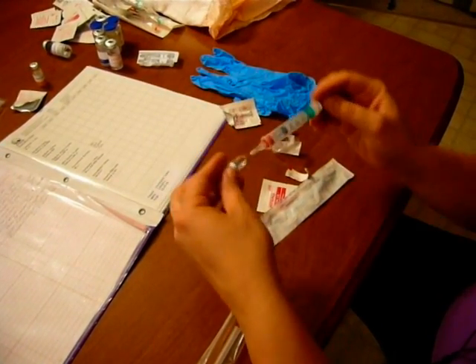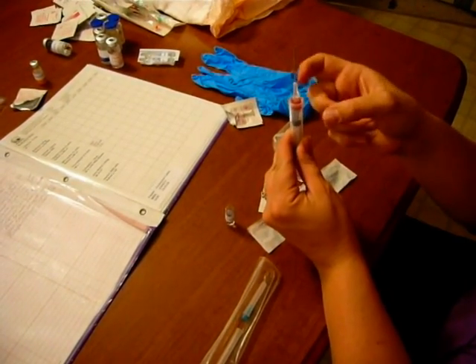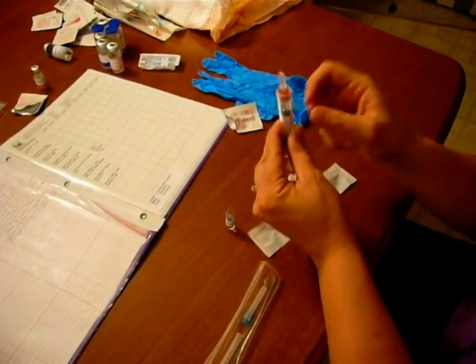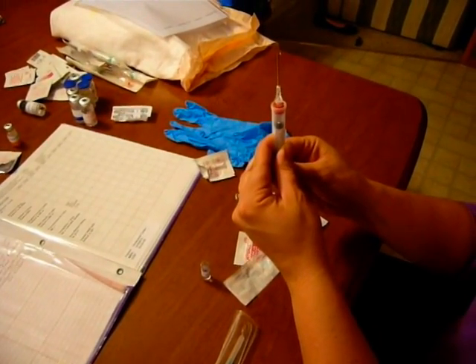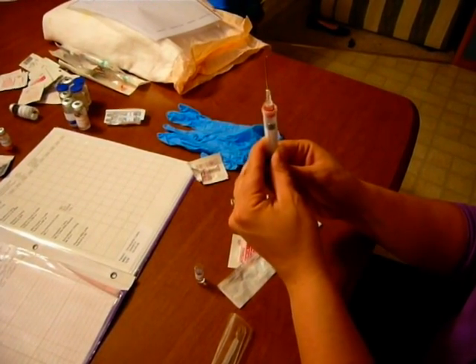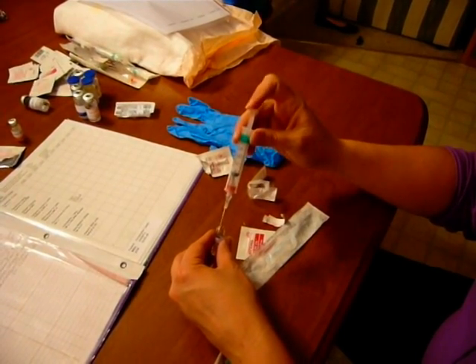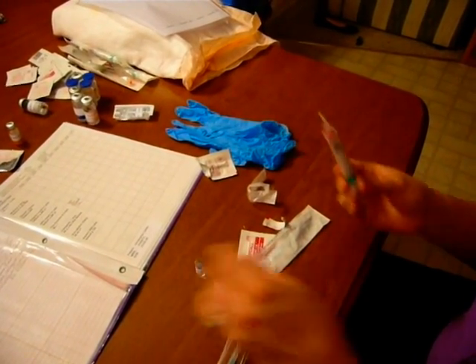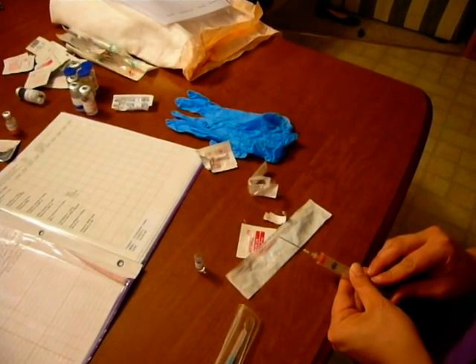We need 0.5 mLs, so I'm going to draw up a little extra. Because of the size of the needle, there will be a big air bubble — I'm going to get all the air up to the top and clear it out. Once I have all the air out and watch for a drip to come up the top, I can insert it back into the ampoule and get rid of the extra, or go over the packaging and get rid of the extra medication that way.